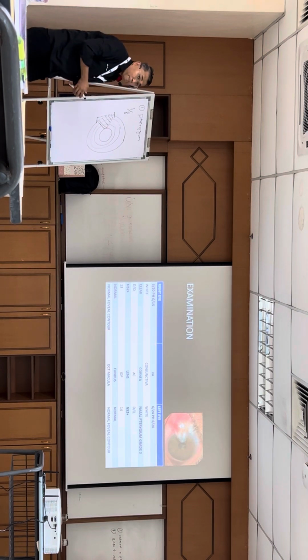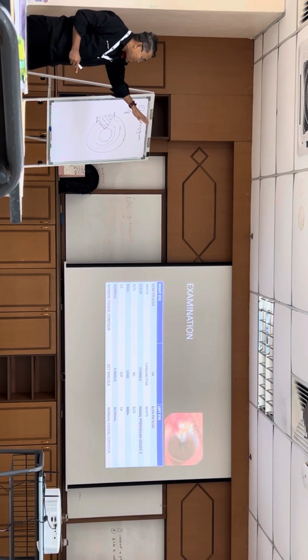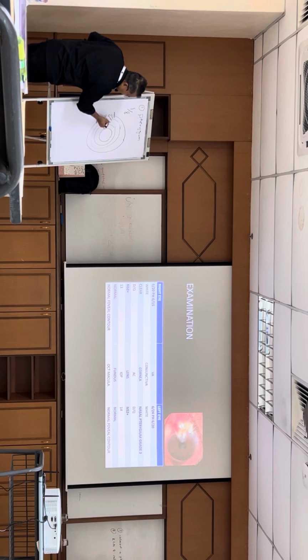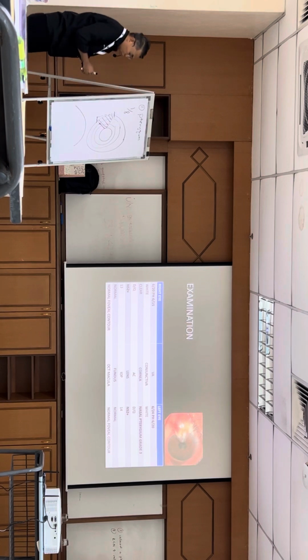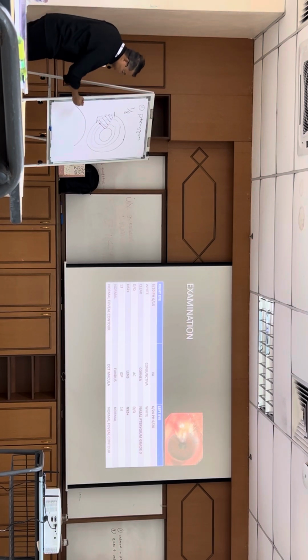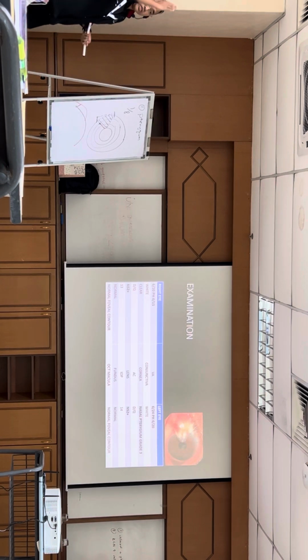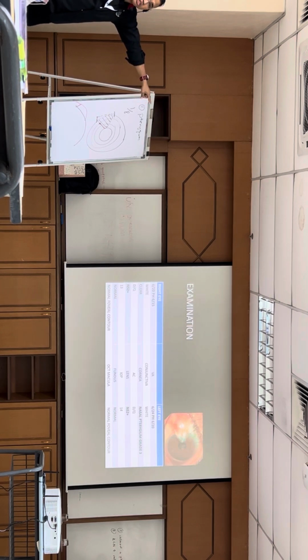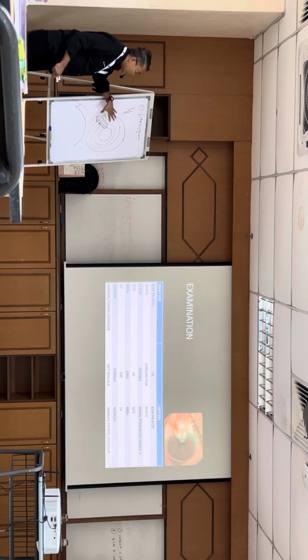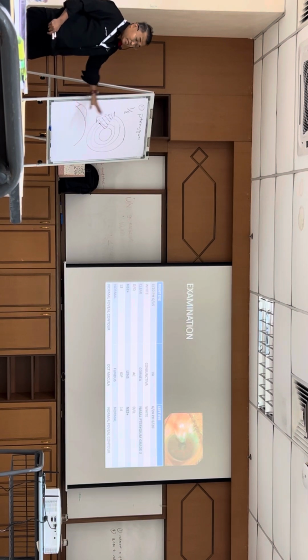The most predictable in our study, looking at how this has been really impactful to the eye, is the thickness of this particular pterygium. So if we draw like this, you can look at the thickness, especially across the limbus. That thickness can cause a lot of problems. And if you look at that, it is highly fibrovascular, and you can see there's a lot of collagen tissue over here. That induces a lot of problems with the curvature over here. Just looking at that, yeah?